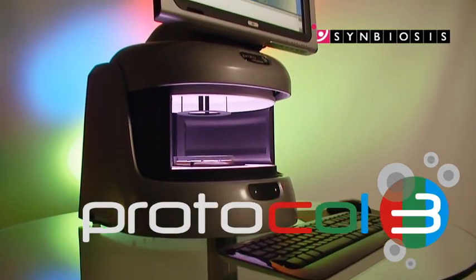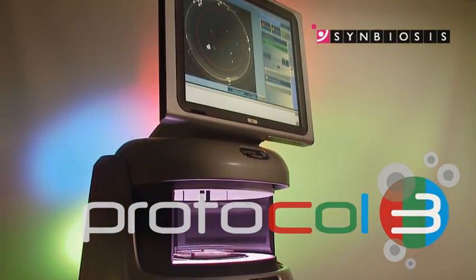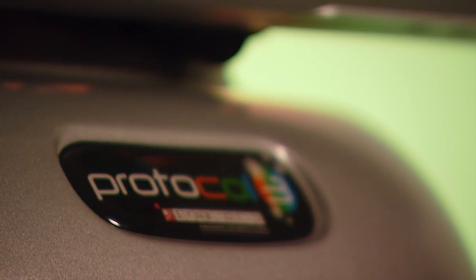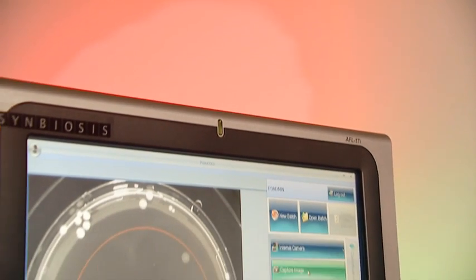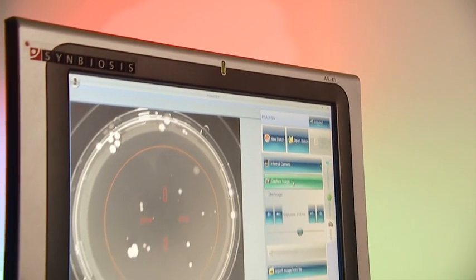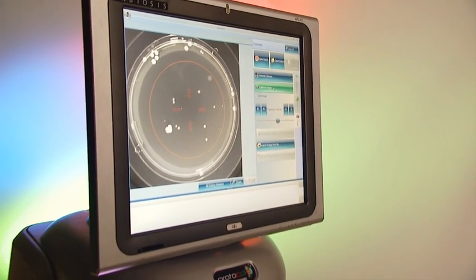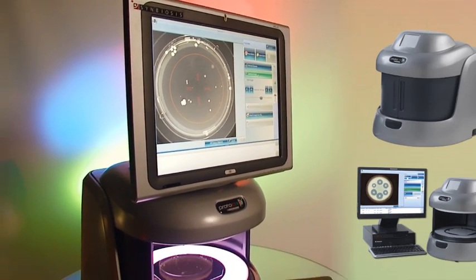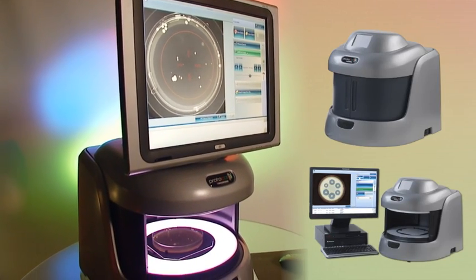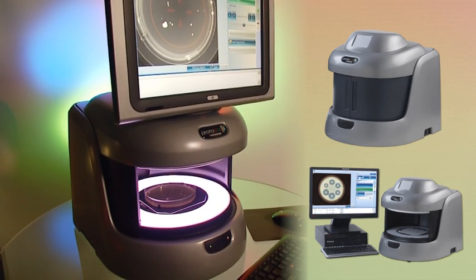Protocol 3 is the next generation, easy to use, automated system for colony counting and zone measuring. The system is available with a fully functional touch screen PC or in a standalone version for your own computer.